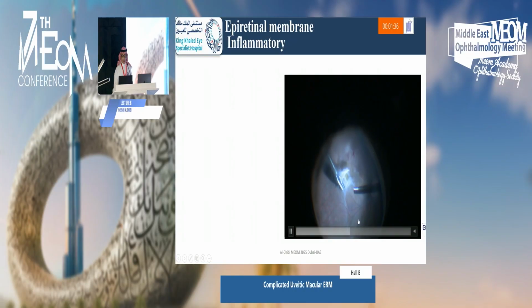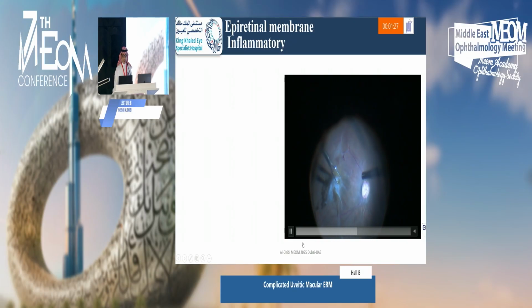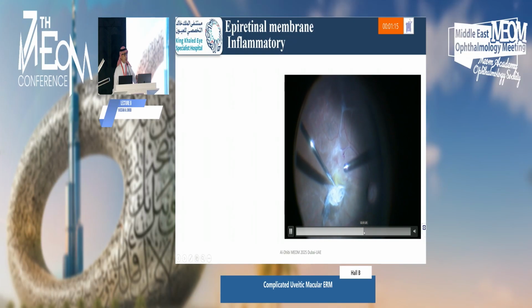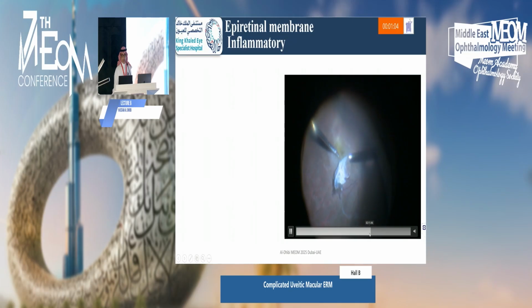Getting in. See it? Now starting here, I couldn't make more progress. You see these large fibrous membranes on the surface and even in the inner layers. So now here I'm stuck. What I have to do is use my scissors to get in, but I'm afraid of penetrating. All of the fovea is especially spongy and seems like an exudative detachment of the macula. So now I'm getting in place, but I couldn't do more.